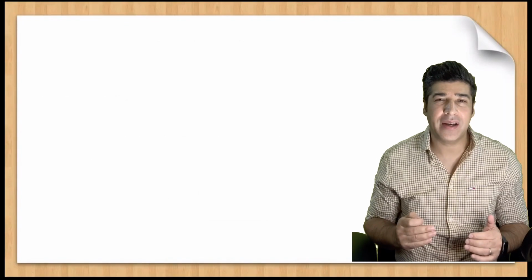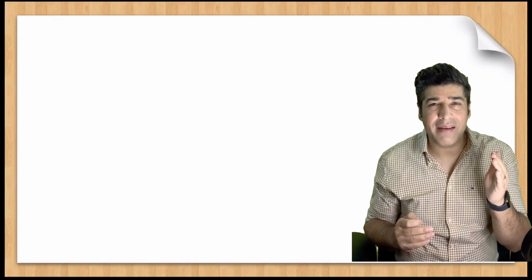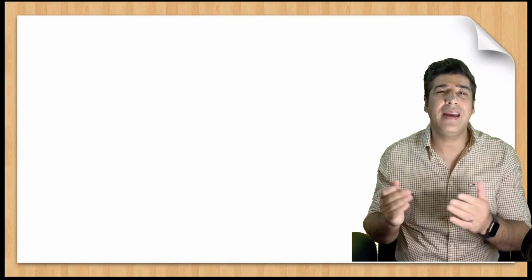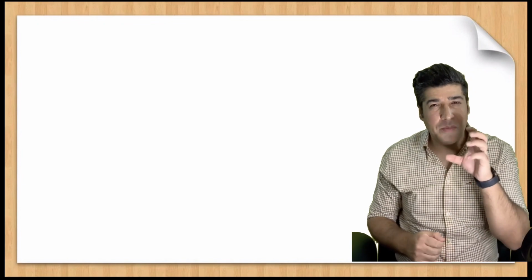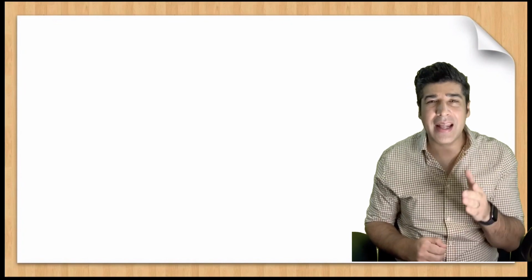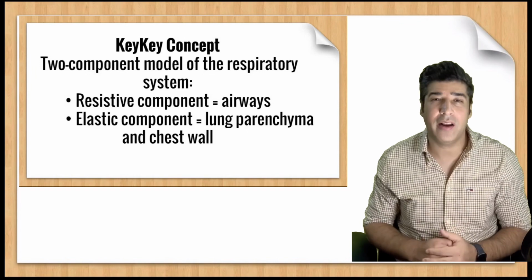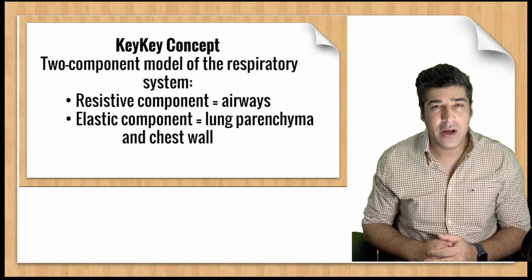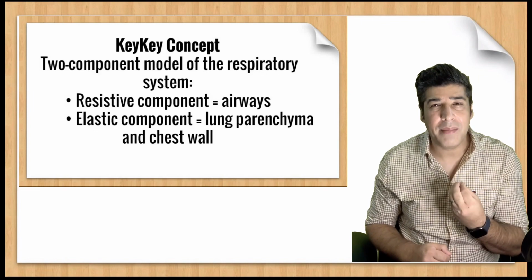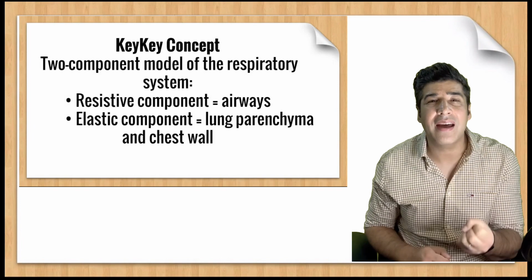Peak airway pressure, the maximum proximal airway pressure during the respiratory cycle, is the result of the resistive component and the elastic component.